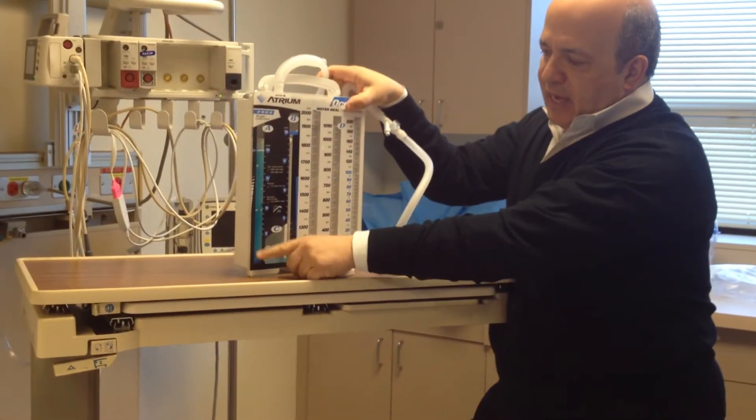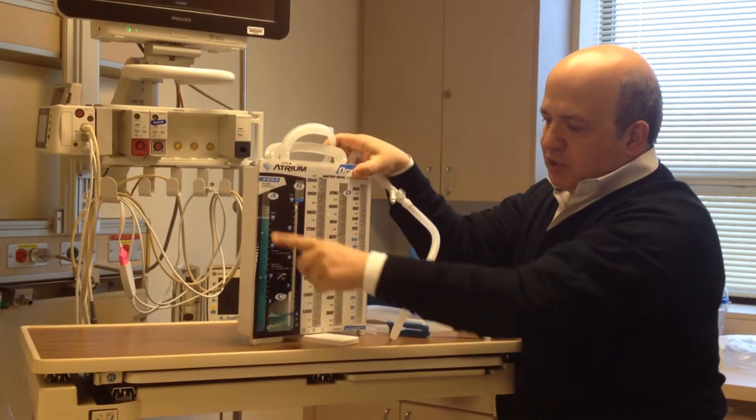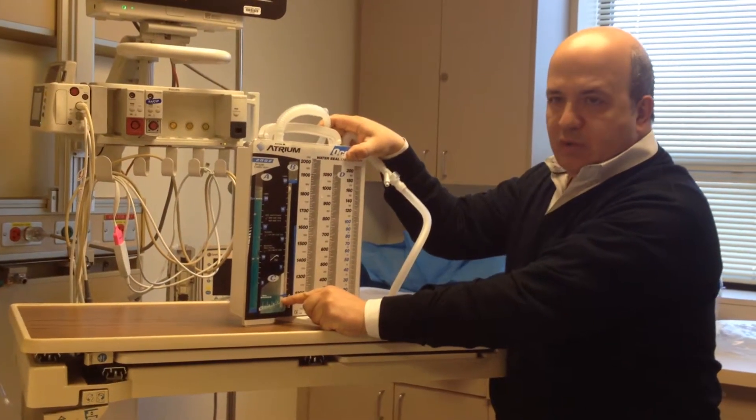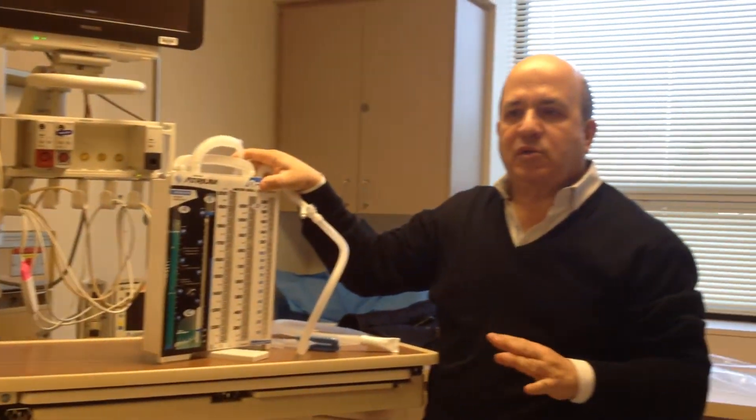When you fill it up, it has to be filled up to this line. This gives you 20 centimeters of water suction. This line here is the water seal — I'll explain that in a second. This goes to 2 centimeters. This level has to be 20 centimeters of continuous suction.